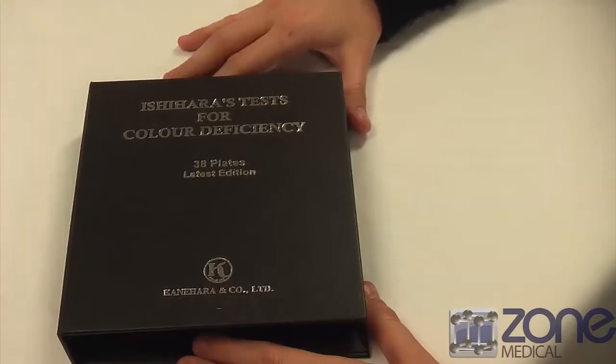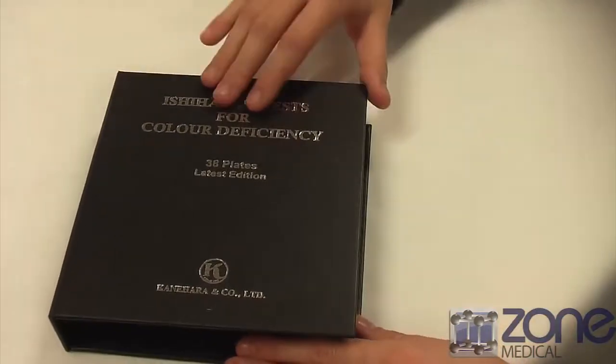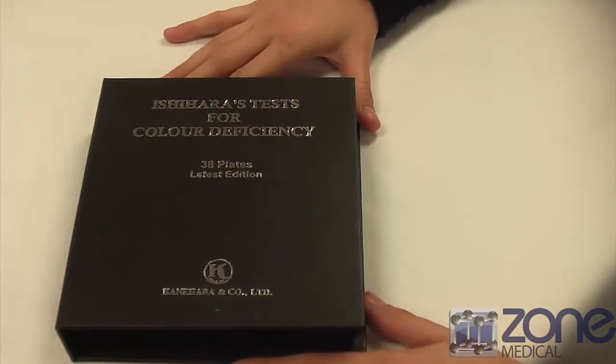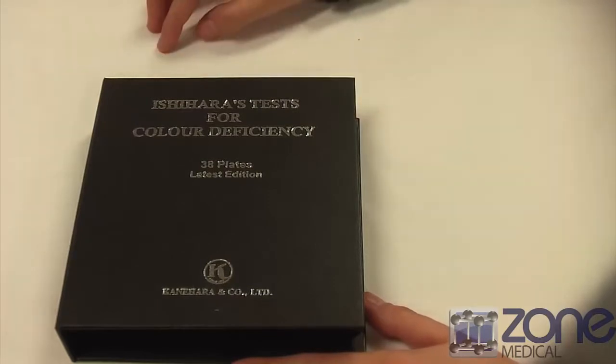Today I'm going to be doing it with a patient of my own just as an example. As we go through the pages, you'll get the patient to just tell you what number they're looking at, and then halfway through they'll trace the pattern with their finger.